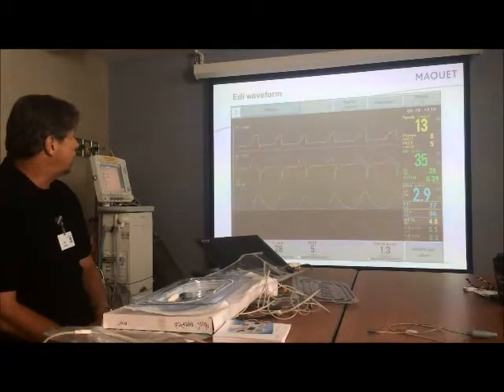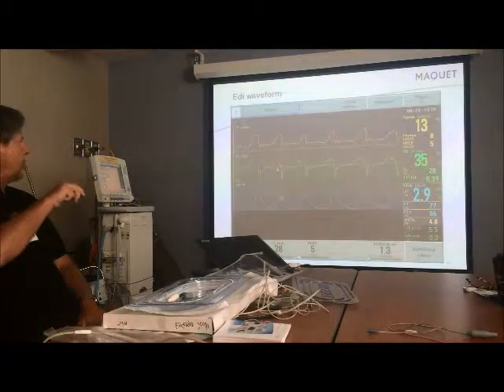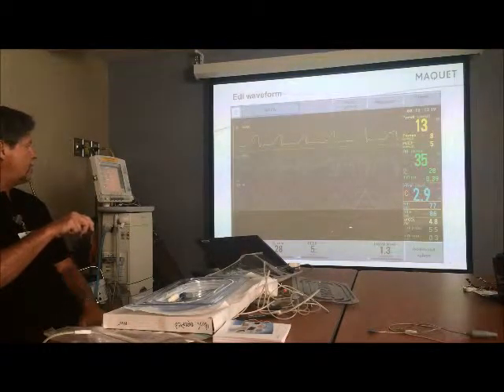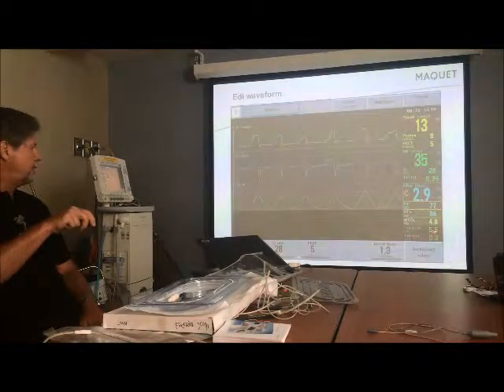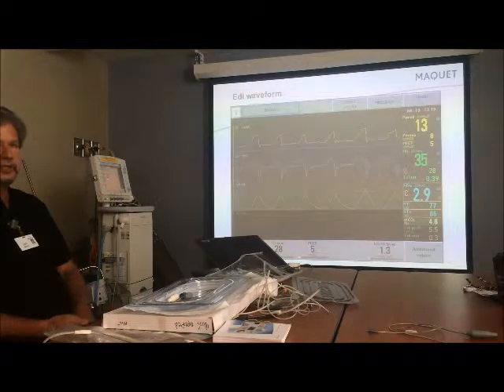So here's what ultimately it will look like on the ventilator. We have our pressure, flow, and volume waveforms, as you'll always see on the ventilator. And then down at the bottom we have contraction, relaxation of the diaphragm. So this is the EDI peak and the EDI minimum down here, which is shown to you over here in terms of microvolts. Wherever it took the reading, 5.5 microvolts was the peak, and the minimum was 0.3. So the minimum and the peak, and that's what you'll see.